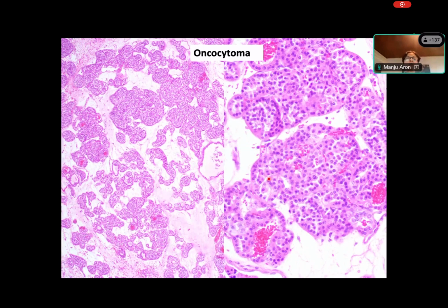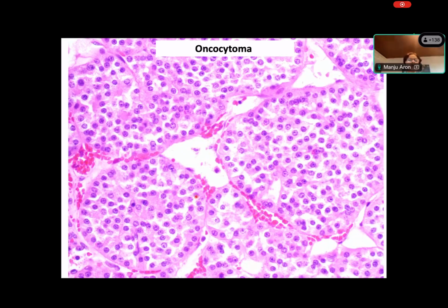Now, here's another common pink tumor, which is an oncocytoma. It's characterized by this nested appearance, edematous stroma, and this very characteristic granular cytoplasm. And the most important thing is the nuclei. The nuclei look really kind of uniform across these tumors. They're round. They don't show nuclear membrane irregularity. And here's a good example to show you the roundness of these nuclei, right? And that really helps make the differential to distinguish these oncocytomas from eosinophilic chromophobe RCC.